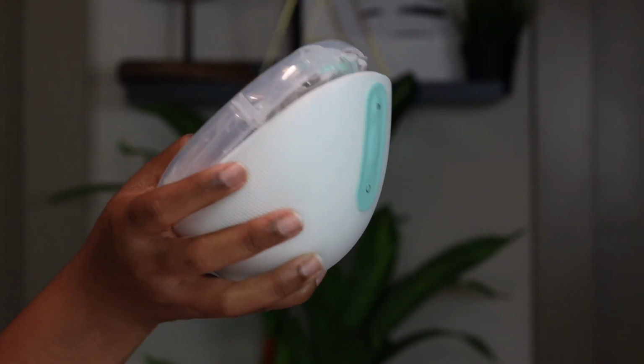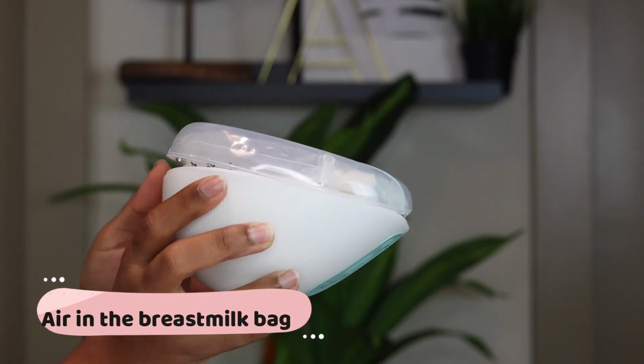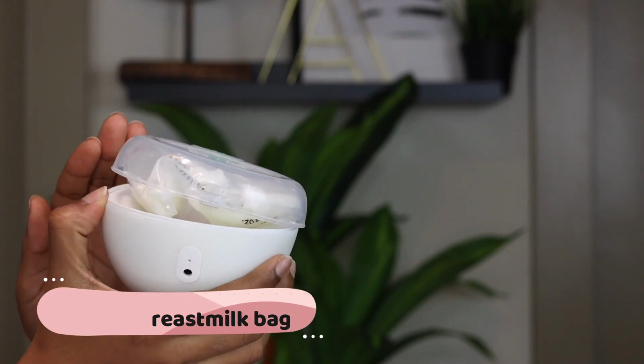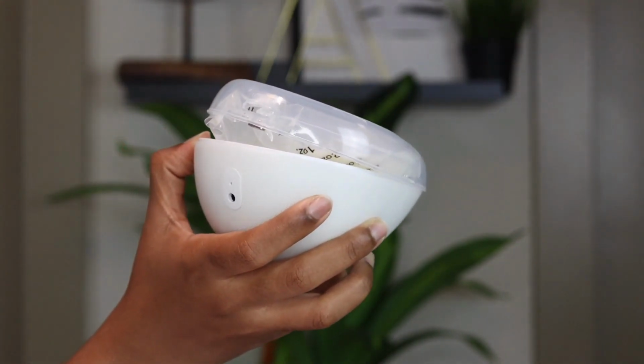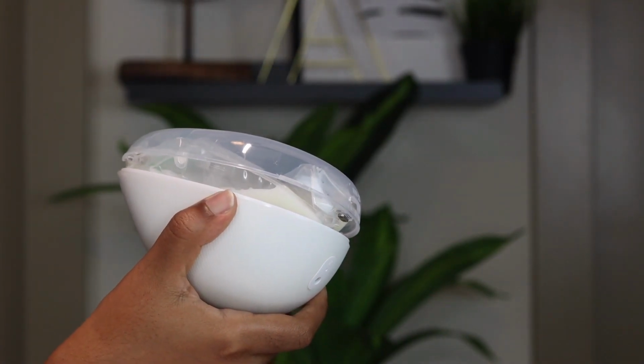Another thing I dislike about the Willow breast pump is when the bag and the flange separate from the pump. So for some reason, when you're pumping, the bag fills up with air, and as you can see here, it actually separates from the back of the pump. And this can actually happen when you're pumping. So it's really inconvenient, and I don't like it at all.